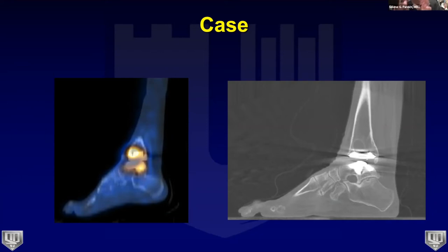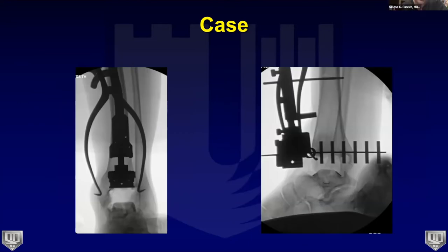The pyramidal STAR cut leaves a challenging volume for revision. With the patient now in her mid-30s and likely needing one or two more total ankles in her lifetime, bone stock preservation is essential. The decision was made to revise to a Cadence with a flat top tibia and flat top talus. The external guide is placed focusing on the level of the horizontal axis cut rather than the peg height, taking as minimal tibial bone as possible.